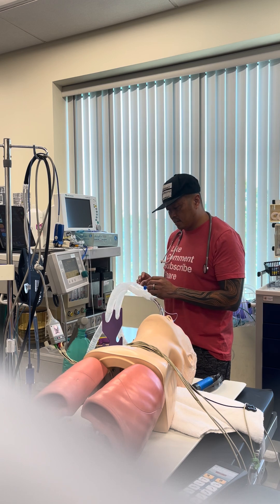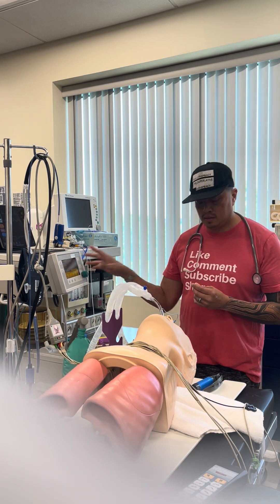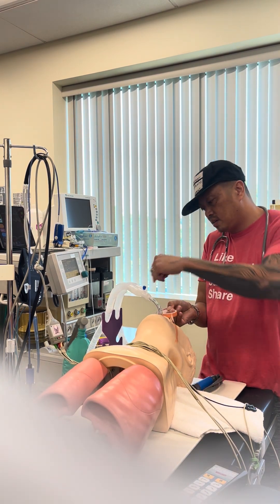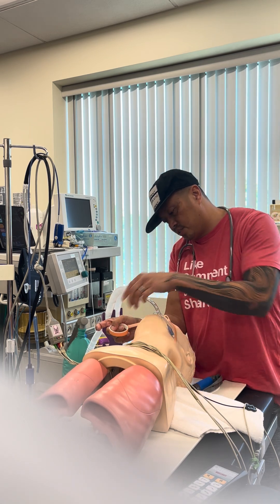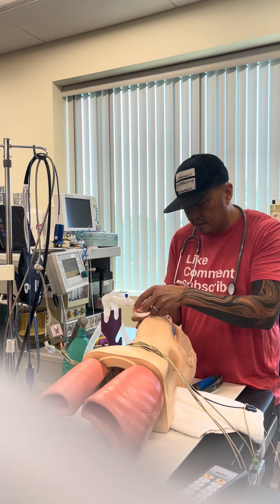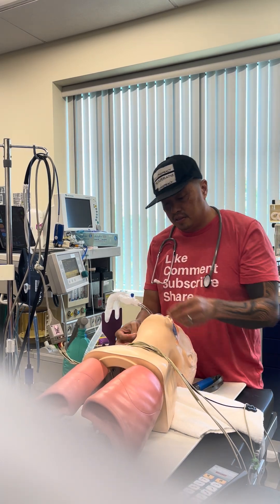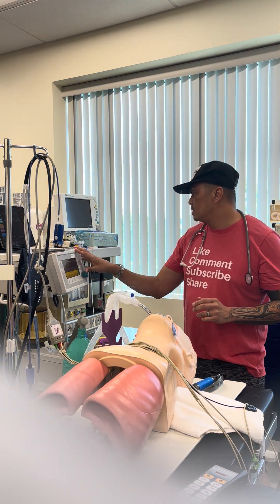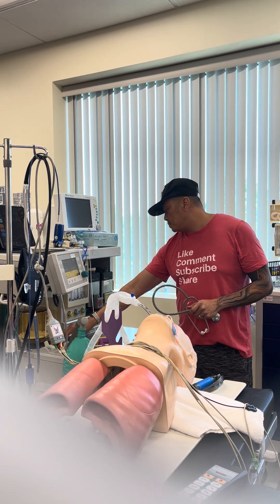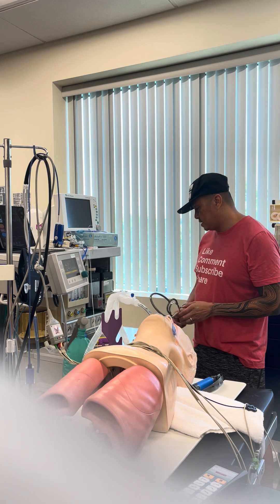At this point in time, I'm going to tape them up and secure them. One more check: I have low flow on, my APL is open, my machine and the monitors are on and working fine.